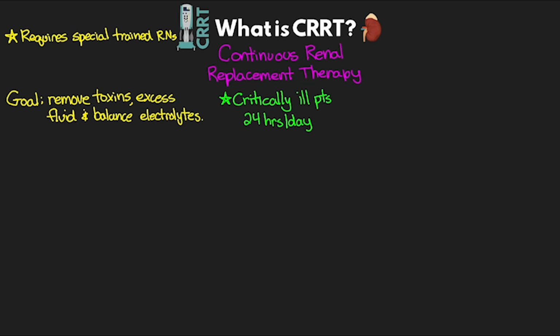Now, these patients are often very sick and, to be honest, quite time-consuming. And in many facilities, these patients who are on CRRT are staffed as one-to-ones. And so the next question we want to ask is, why is it that we use CRRT?